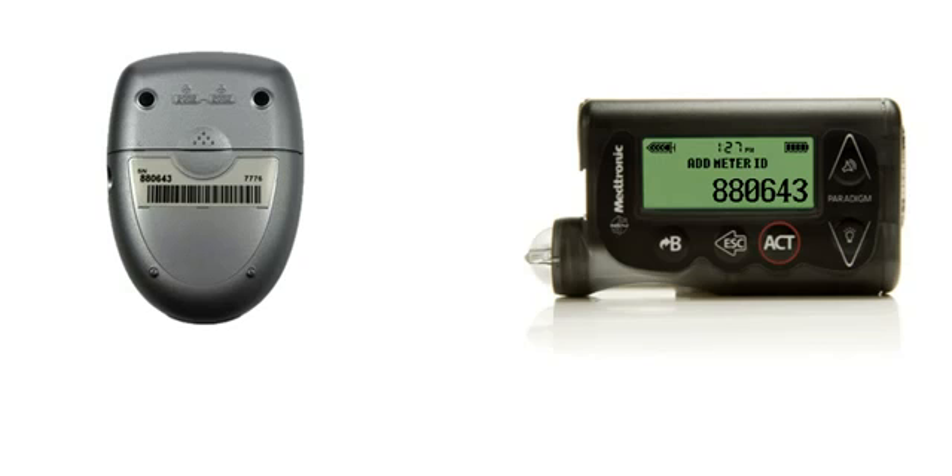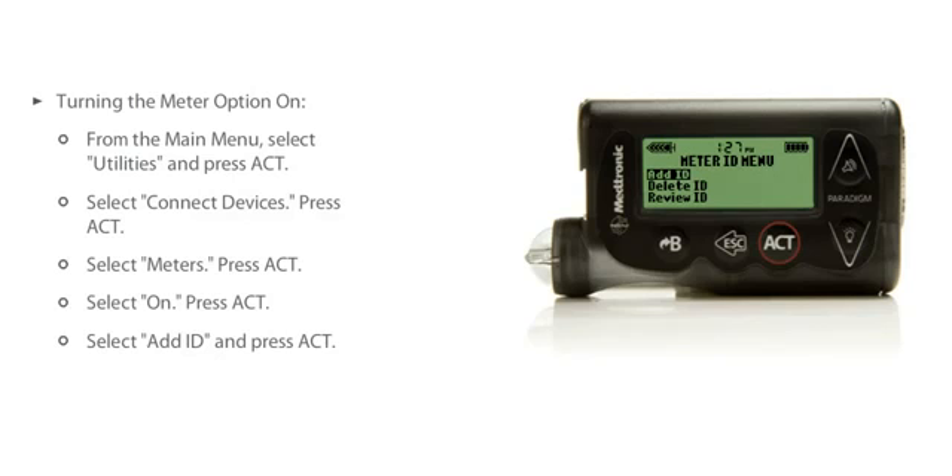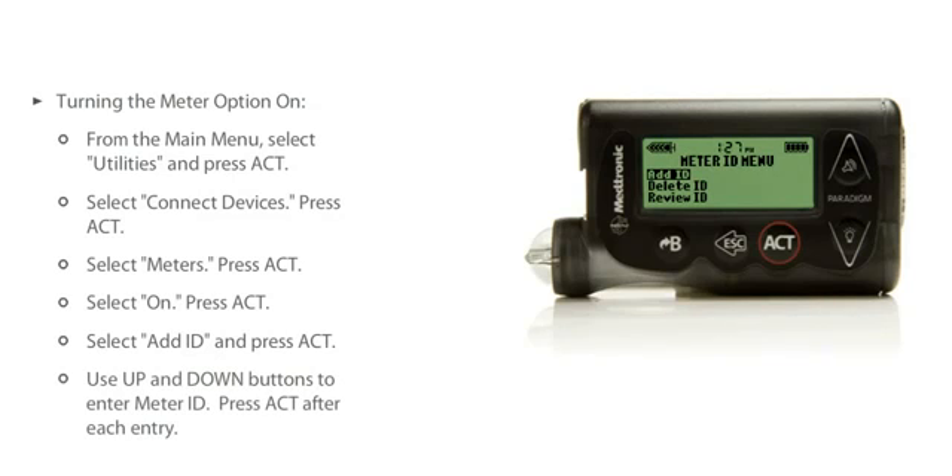After you set the last character of the ID, the screen will return to the Meter ID menu. If you want to add additional linking meters, select the Add ID option again. Up to three meters can be linked to your pump.